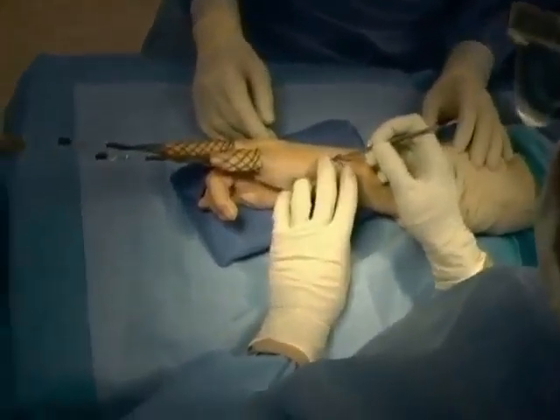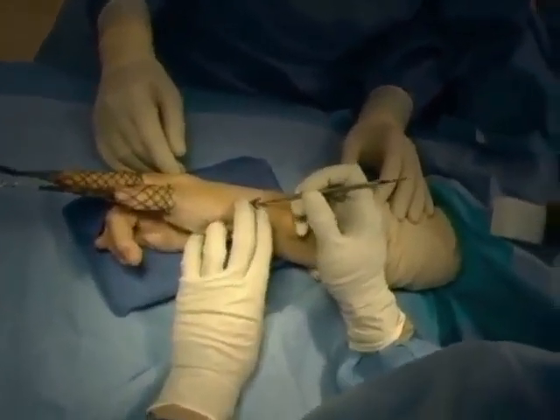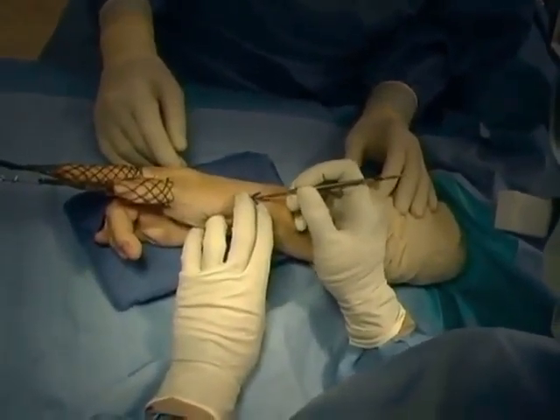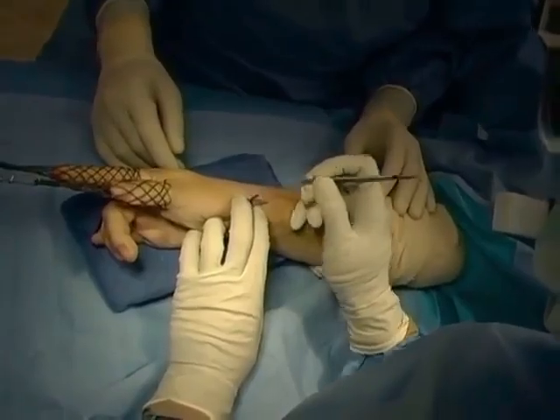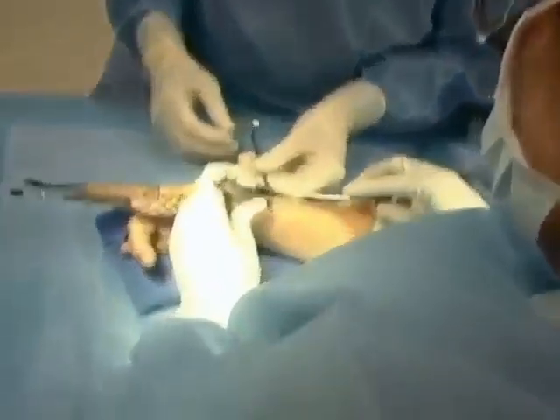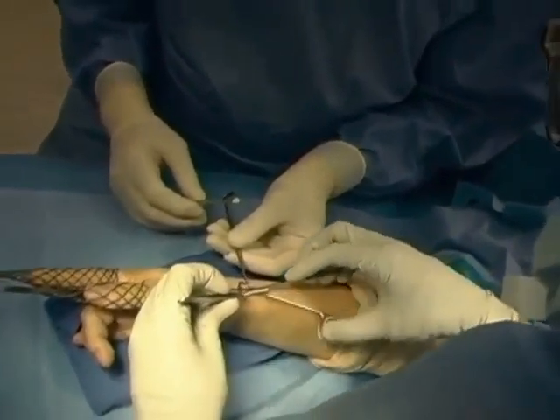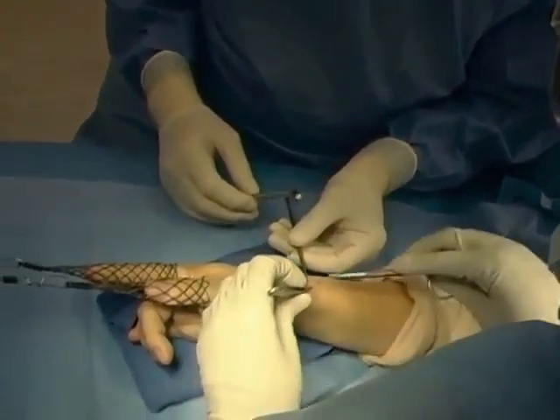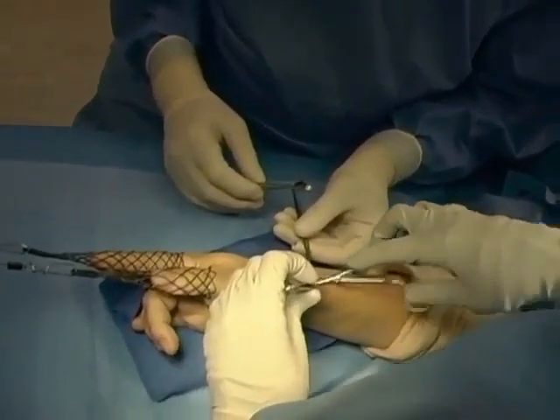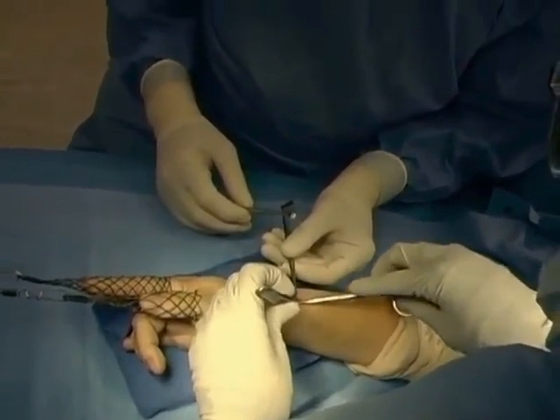In order to place the K-wires through the radial styloid, a small exposure is made about one centimeter in length distal to the radial styloid. The purpose is to identify and retract the branches of the superficial sensory branch of the radial nerve, as well as the contents of the first extensor compartment.